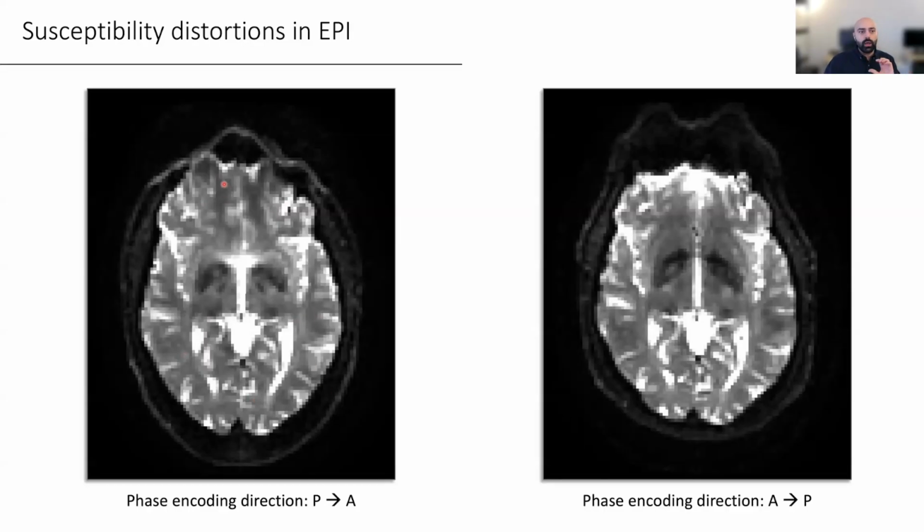Yes and no. There are local interactions that make the magnetic field no longer homogeneous. So these are also called inhomogeneity distortions, because the main magnetic field that we think of as exactly 3T is experienced as slightly different than 3T at different locations.